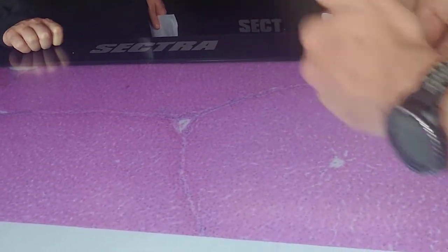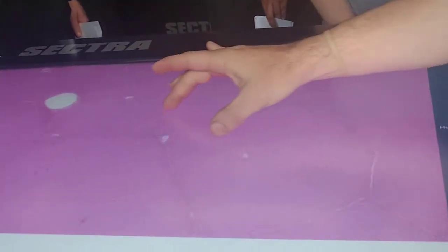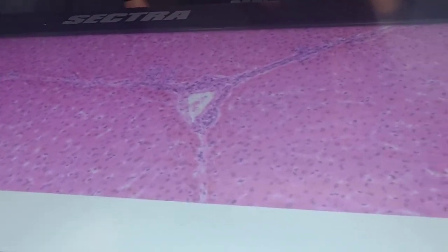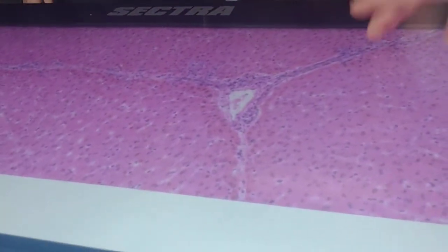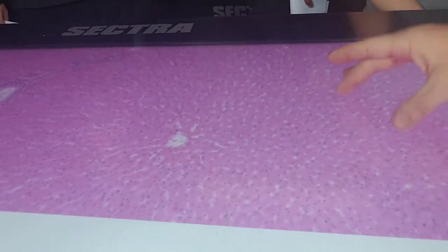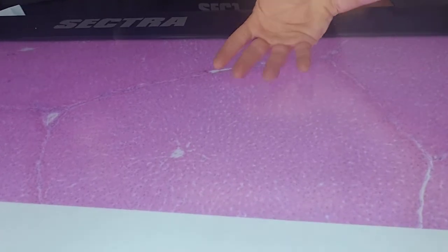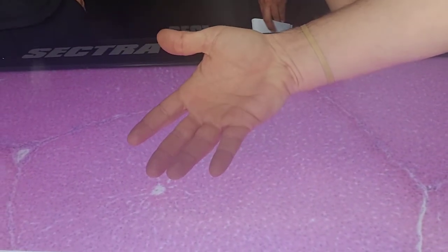All these central veins are going to leave, and they're all going to be connected to places like here, where we've got a hepatic vein. That's a hepatic vein, not a portal vein, because it's draining these lobules, and it's going out to the vena cava. So we've got portal blood from here draining through the sinusoids. All these little pink cells are filtering it, and that's going here, essentially into the vena cava, through the central vein.